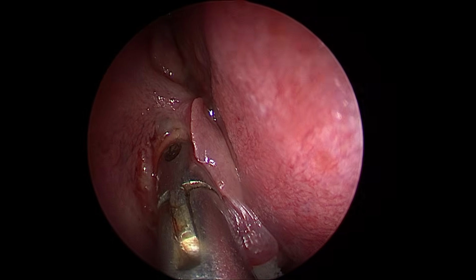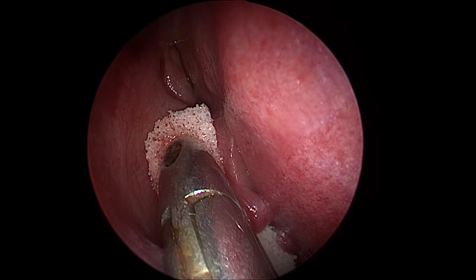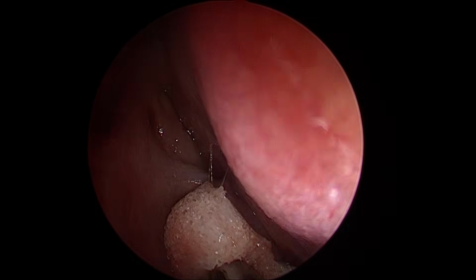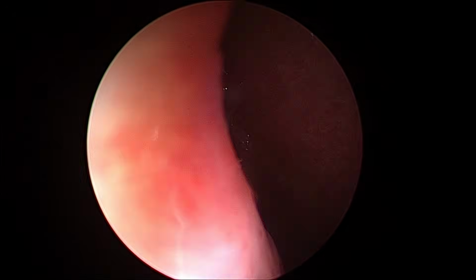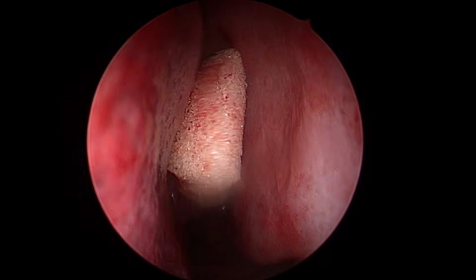So you have to be very good at radiology and have clinical suspicion for a unilateral, not completely watery polyp in an elderly patient. That is the first way of picking it up. And then MRI is the game changer. This is the left side, this is the right side.